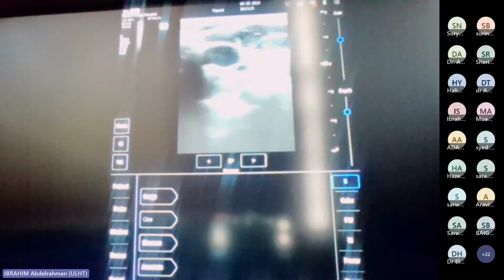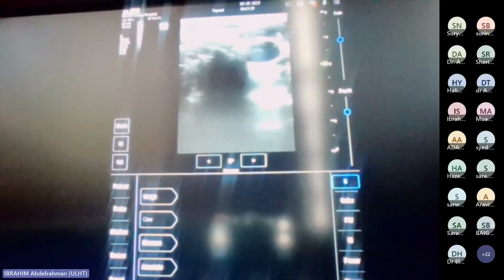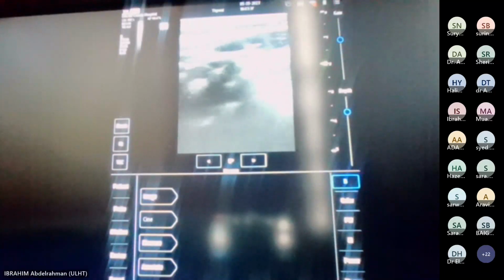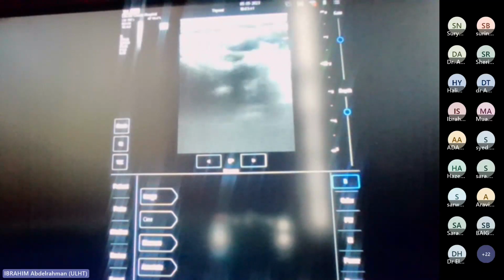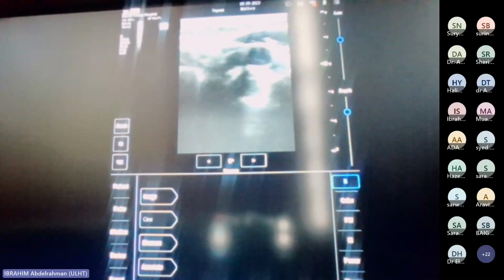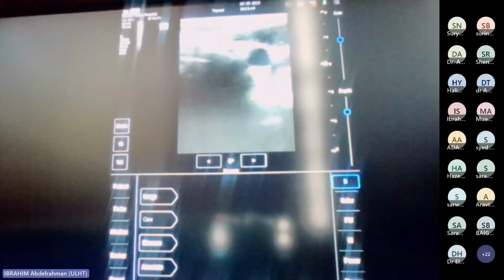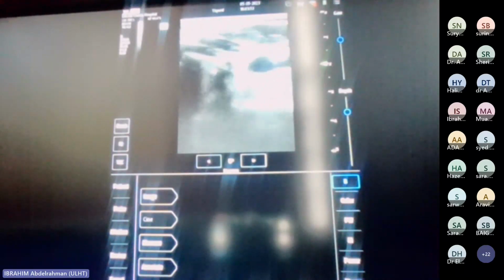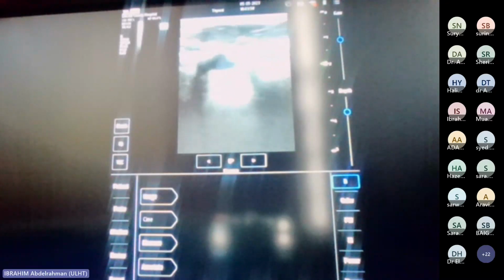So again, here we have the SCM. The thing with the SCM, though, is it goes down the whole neck, so you can't tell which lymph node level you're at. If trainees send me an image like that, I'll say, well, I don't know what level you're at. I can see the anatomy, but you either need to label it for me or give me a bit of anatomy that I can then see. If there's a bit of submandibular gland on there, I know it's level 2. If I can see the hyoid, I know it's level 3.